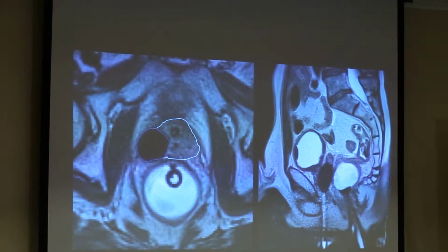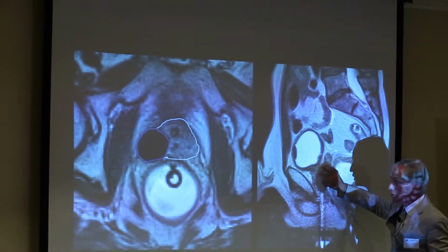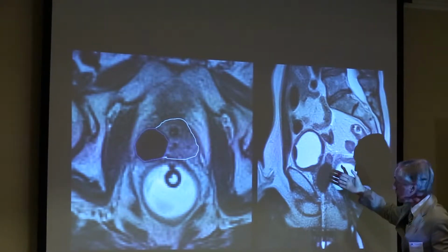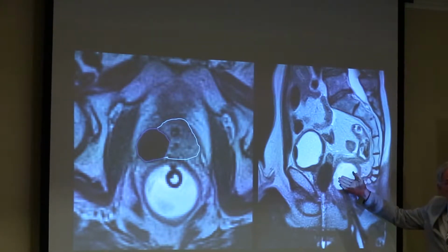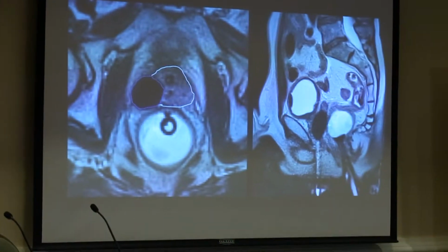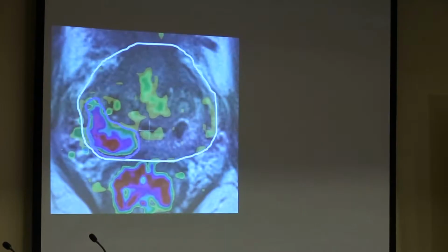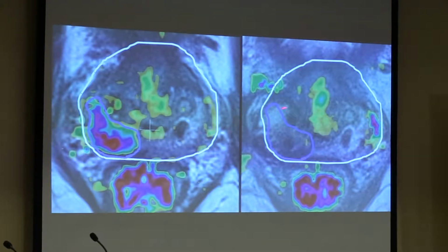The gradient, the freezing gradient using a warm water and ice ball is steeper, so you can be more accurate and you can do more than if we're not using this. With ultrasound cryo that has been done before, this is impossible because you don't have the possibility to fill the rectum with the balloon because you have to put in the endorectal probe for ultrasound. We did 60 cases until now. We had 3 recurrences. A recurrence you can retreat again. So this is before, and this is the situation after. No vascularity anymore. So this patient had a successful cryo.